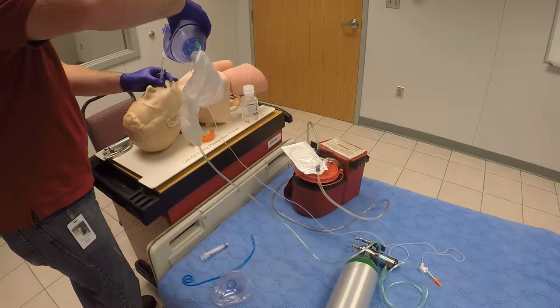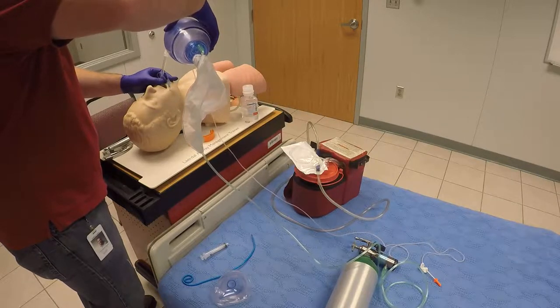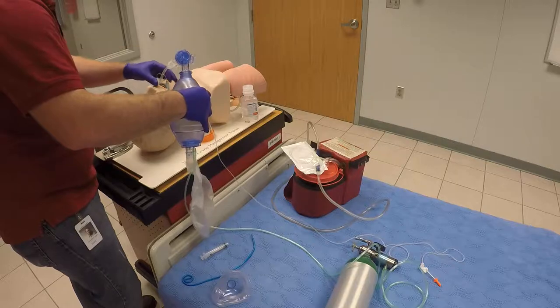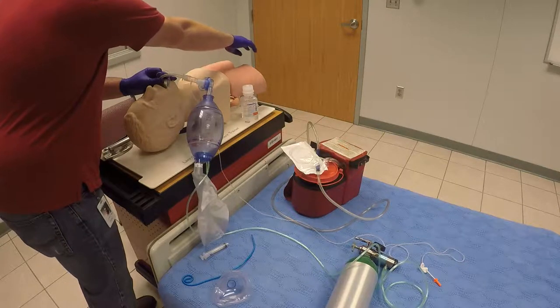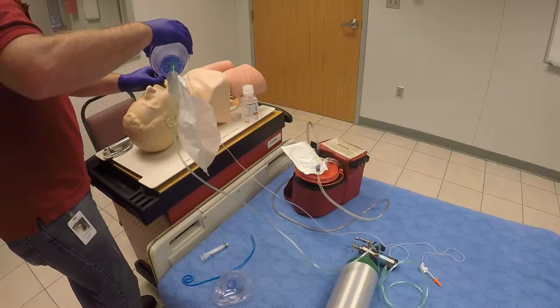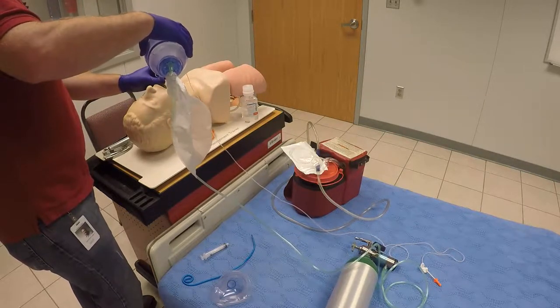Maintain a rate of 10 to 12 breaths per minute, checking for good chest rise and fall. Check for waveform capnography, or if you have a colorimetric device, make sure you have that gold color change. Continue oxygenating the patient. Auscultate lung sounds over both lung fields and over the epigastric area, noting absent epigastric sounds. Once confirmed, assess for any hypoxia during the intubation attempt — if there's any cyanosis around the lips or if your SPO2 dropped below 90%, make sure you are properly oxygenating.